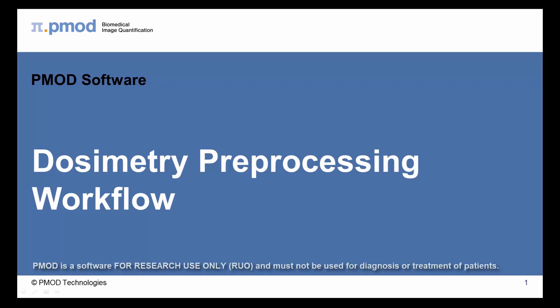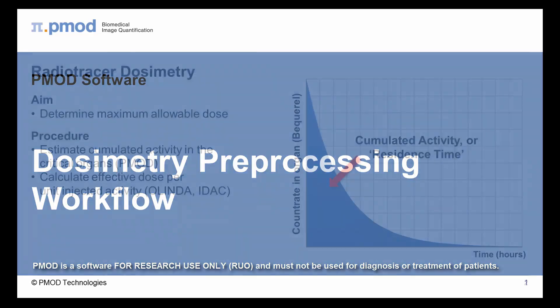Hello and welcome to the PMOD introductory series. In this short video we will provide a brief overview of the PMOD workflow for dosimetry preprocessing.